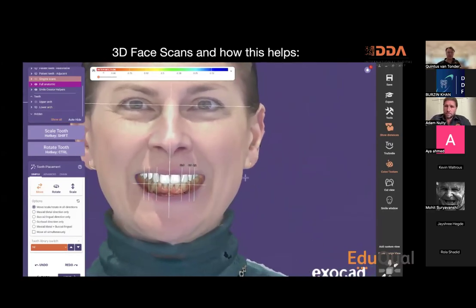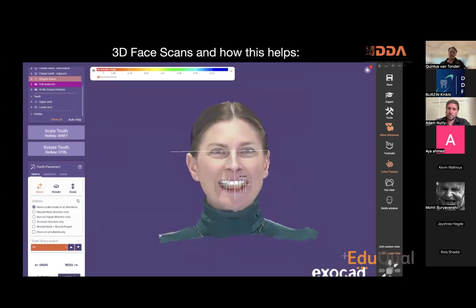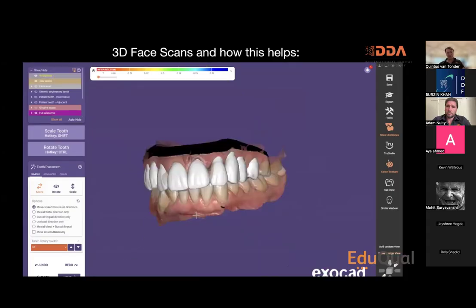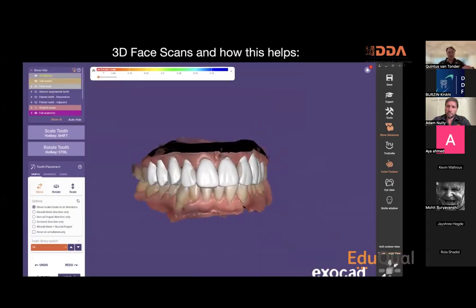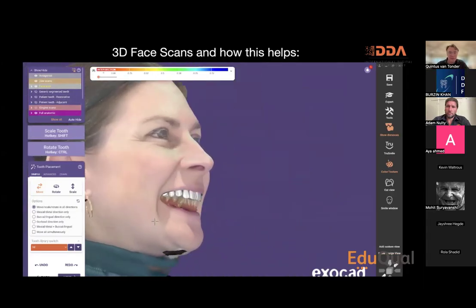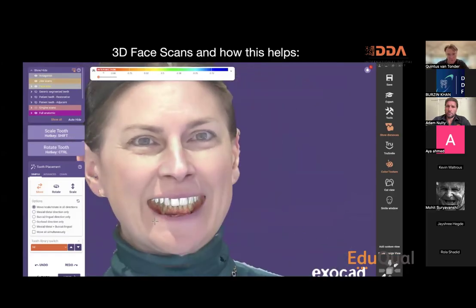Sometimes patients don't hold their head completely horizontally. Sometimes the eyes are not at the same level, and then they tilt their head slightly to have the eyes be basically horizontal because the brain compensates for that. That means that the face is slightly canted, and we have to design to those positions because that is how the patient will hold their head.